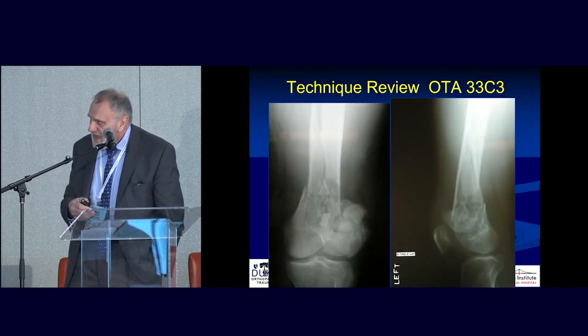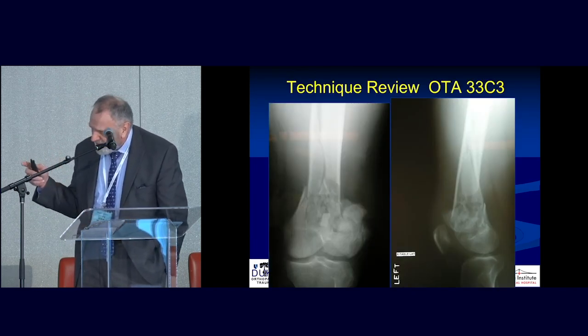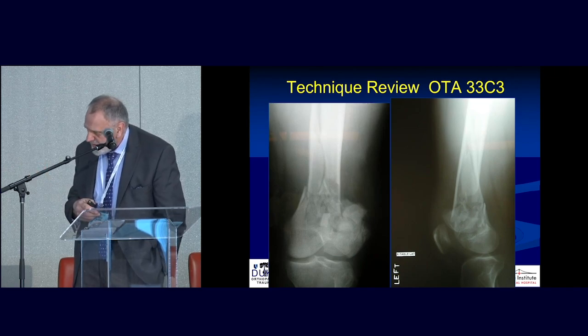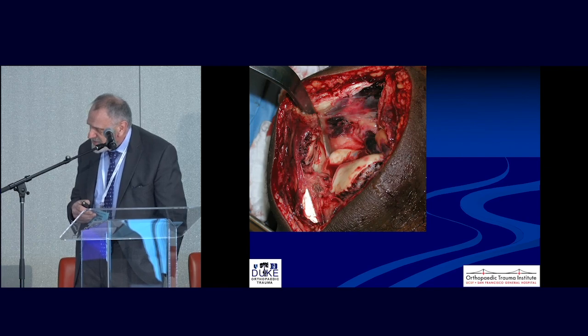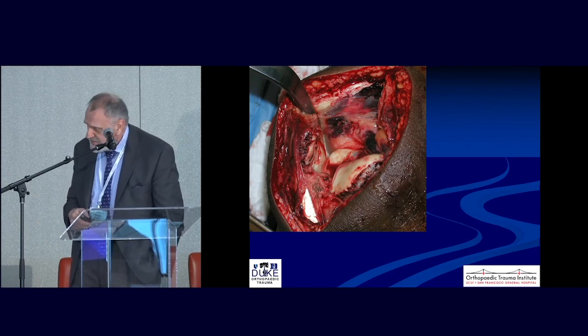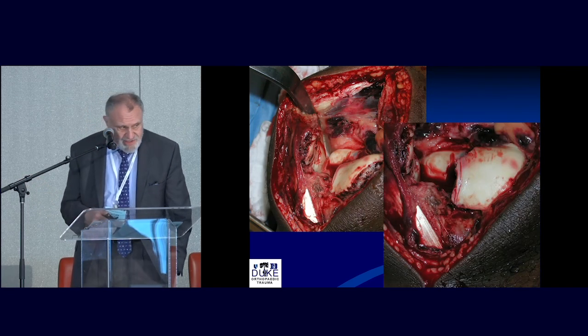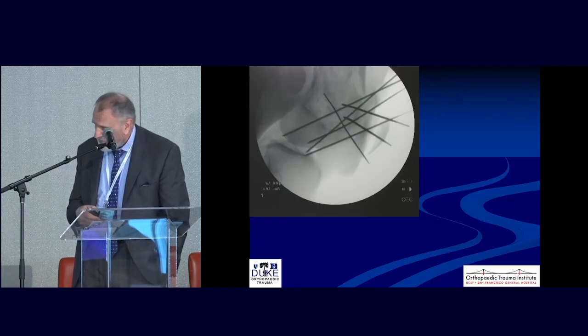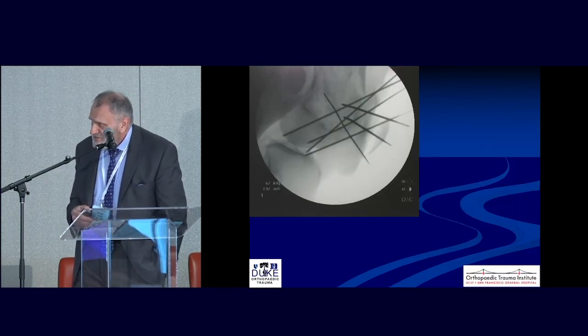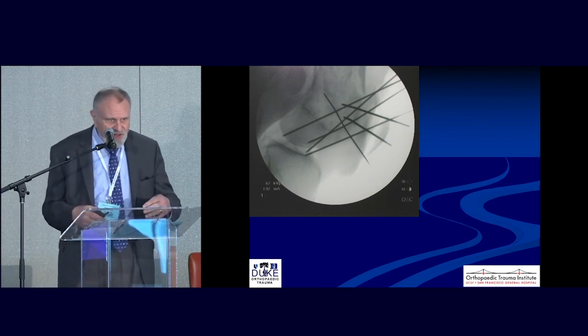So with that as a backdrop, I want to just review a little bit, augmenting what Christian talked about this morning. You get this complex injury with a complex articular component, and you can do the parapatellar arthrotomy, no question. It gives you great access, where you clearly need to see the articular surface so you can really put it all together. And so you do that, you do this K-wire cage, and the guys from Harborview look like you fell into a box of K-wires.